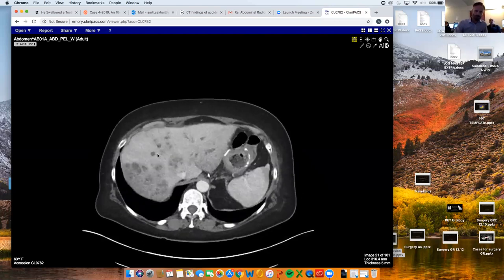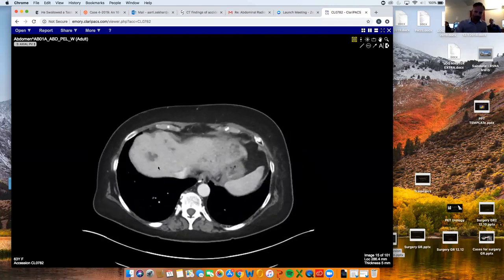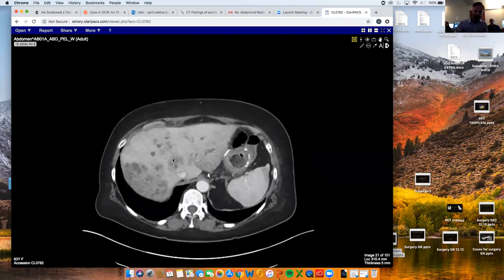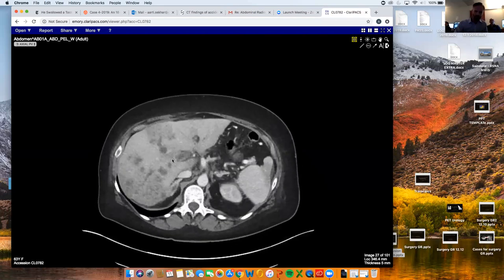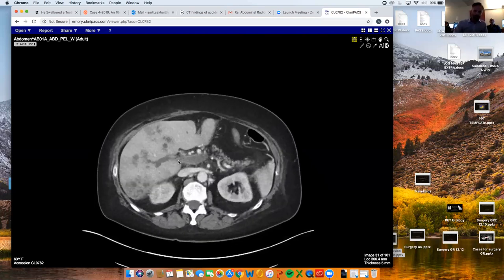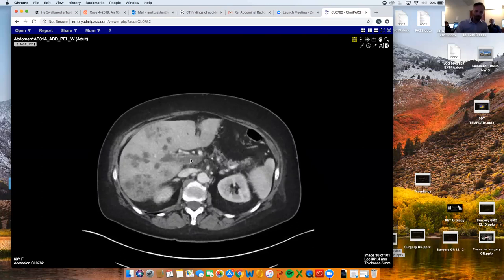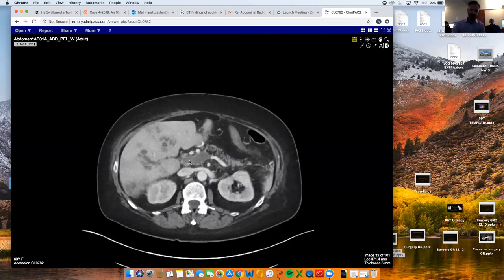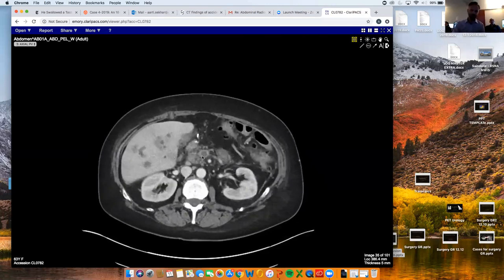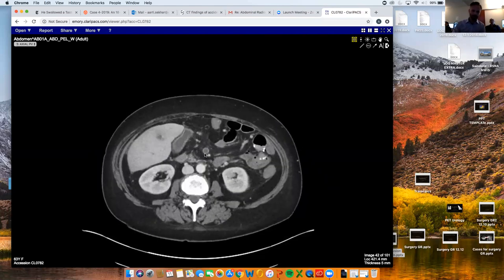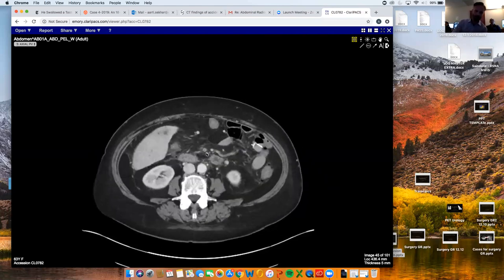All these tiny little fluid collections throughout the liver are tons of micro abscesses. And she's got infection — the vein is infected. So it's pylephlebitis of the portal venous system and the superior mesenteric vein.